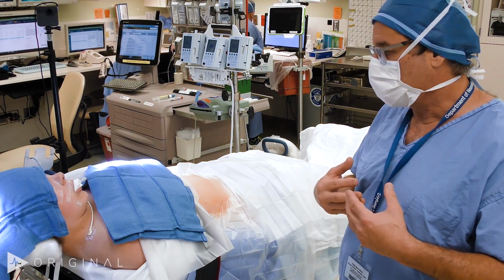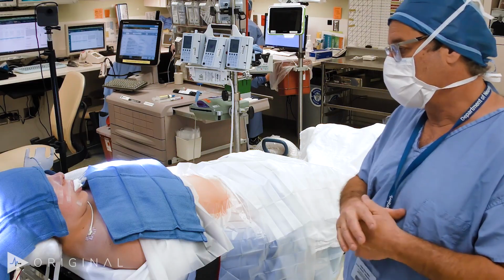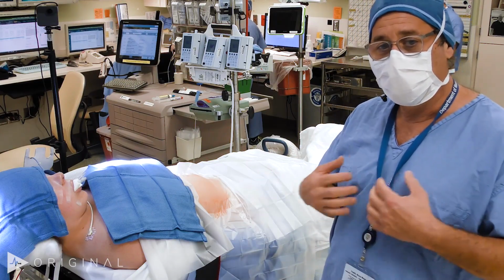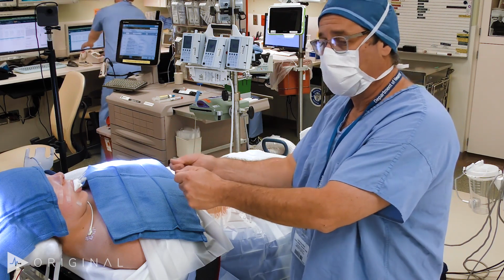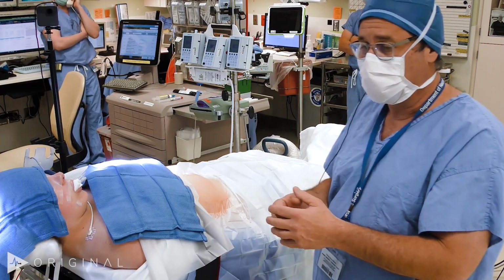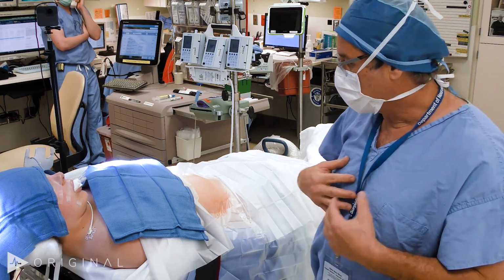For me, we do this transnasal, transsphenoidal, with a combination of the endoscope and the microscope. Typically, my ENT colleague will use the endoscope. They're very adept and quick at it. Then I move the operative microscope in. The reason I prefer to use the operative microscope is it gives me two hands to do my operation quickly. I'll then use the endoscope to look around corners. But in that combination approach, we find that our pituitary surgery takes perhaps 70 minutes from skin to skin. It's quick, safe, efficient.